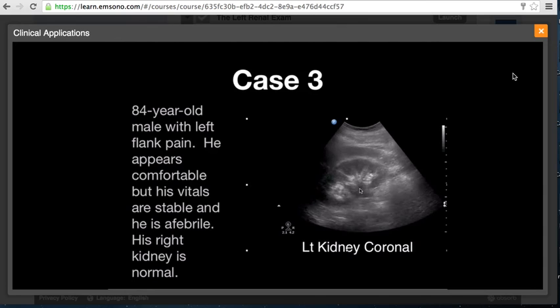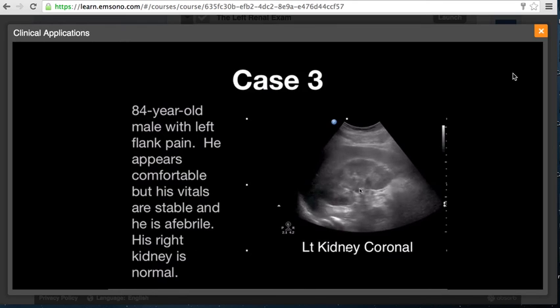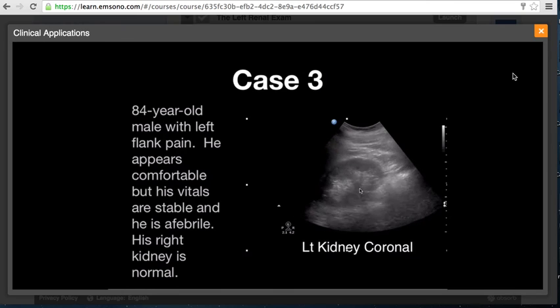The most important thing to remember on this patient is that he's got obvious risk factors for having a AAA. He was somewhat obese, so you couldn't feel a pulsatile mass. This patient had an aortic ultrasound performed, which ruled out the presence of a AAA. So just want to bring that point up. I know we've done this several times, but remember, flank pain in an elderly person or someone at risk for AAA, you've got to rule that out before settling on the diagnosis of an obstructive uropathy.